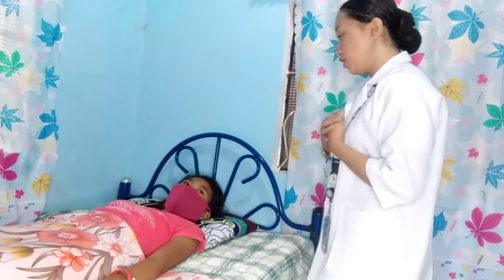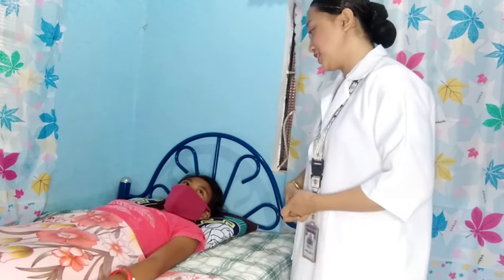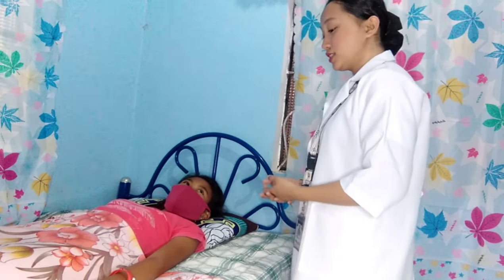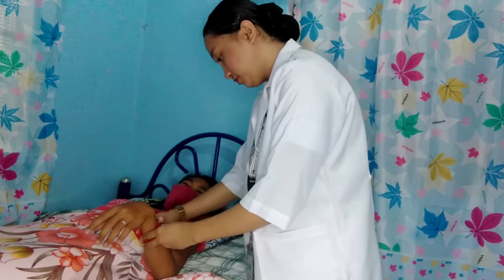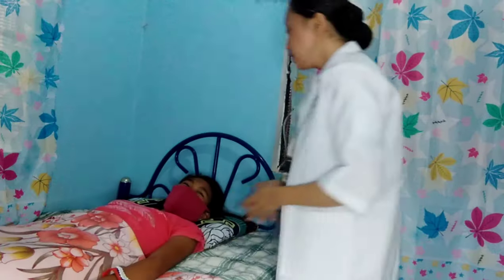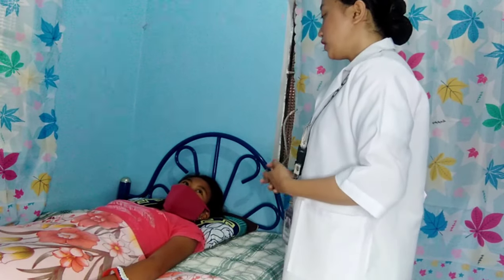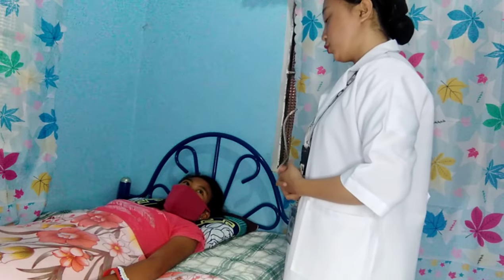Good day ma'am. My name is Melody Bacobo, student nurse from Nueva Ecija University of Science and Technology, and I will be your student nurse for today. Is that okay with you ma'am? May I know your name and birthday ma'am? Thank you. Today I'm going to insert a Foley catheter for you for the treatment of your bladder distension and for your comfort. Is that okay with you ma'am?